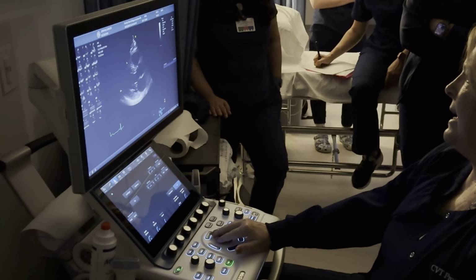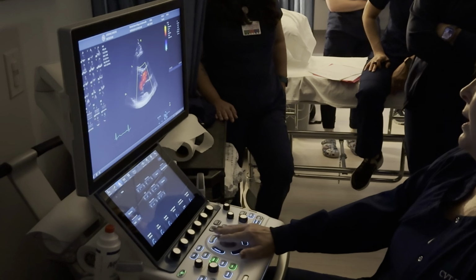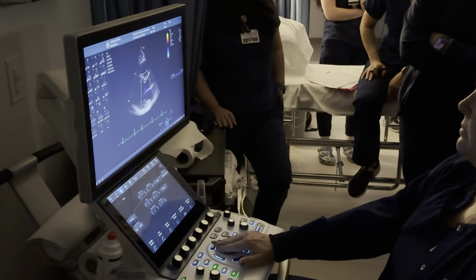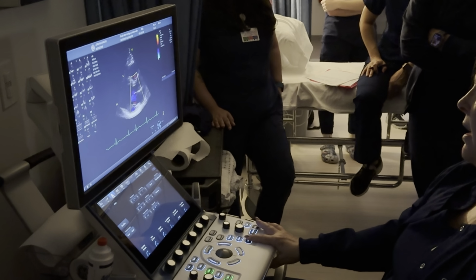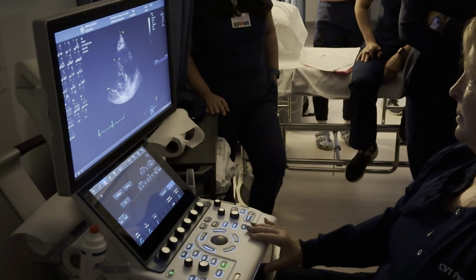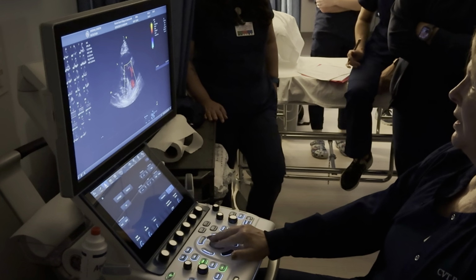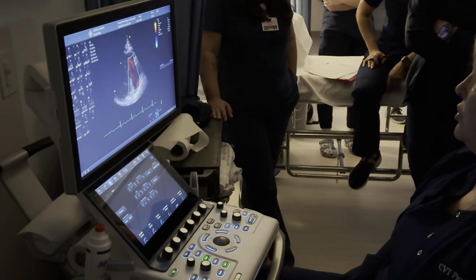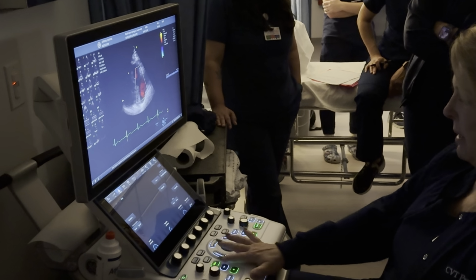So if you'll see that once I get this color box where I want it, I always want it as small as possible with it covering what I need to cover. Then I don't typically change it. I move it, but I don't typically change the box size. I like to kind of keep my box size.